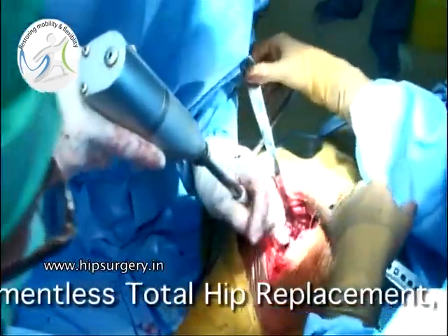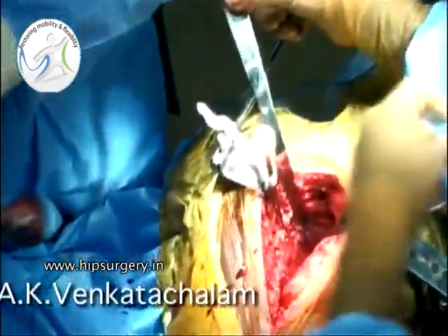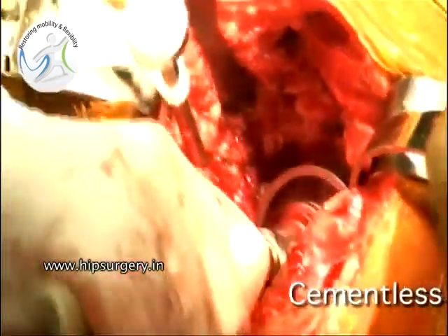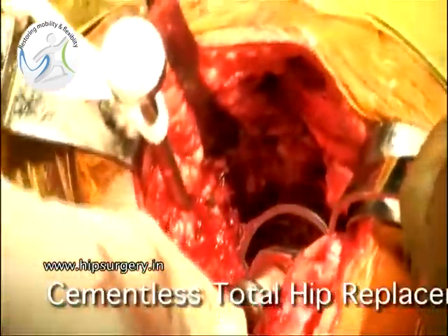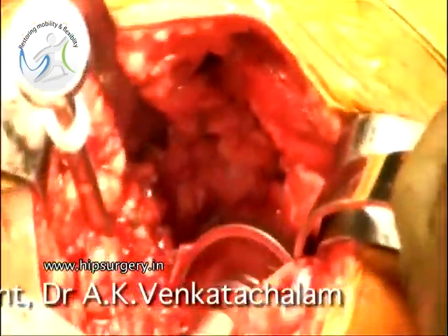All soft tissue is removed. Reaming is commenced with the smallest size reamer, and sequential reaming of the acetabulum is performed.